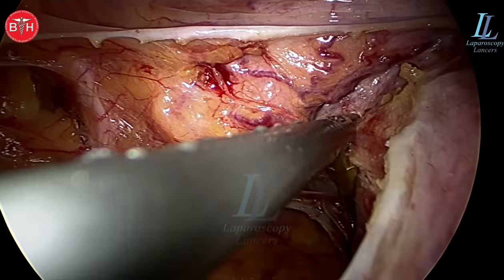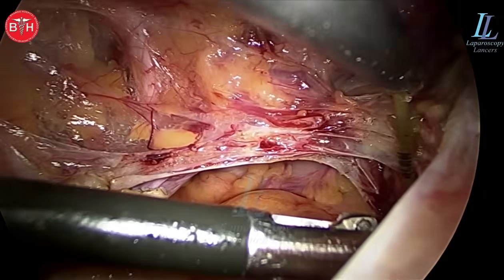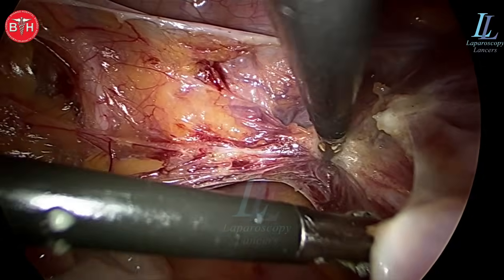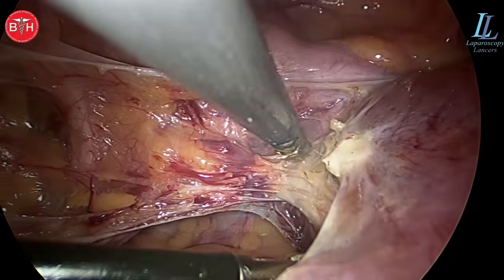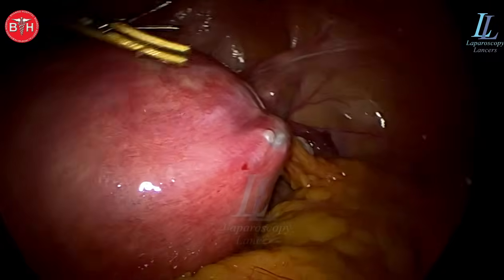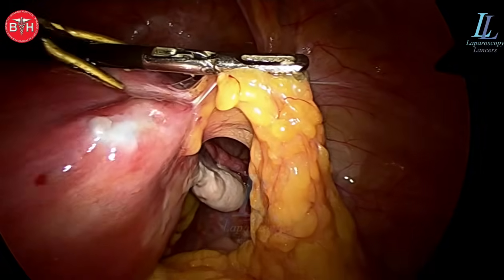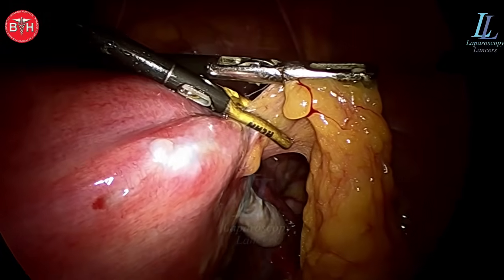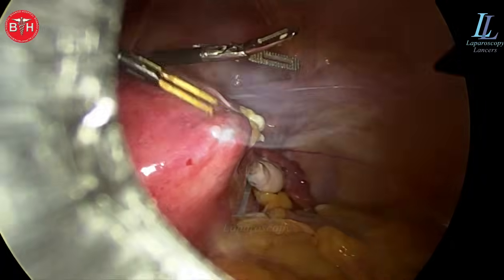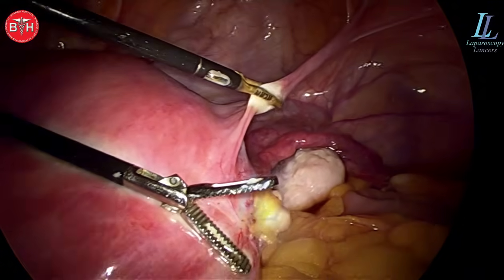Use the Marwa's manipulator as it pushes the cervix so nicely that the fornices are there for the dissection. A bit of coagulation — this two to three centimeter of coagulation towards the uterus avoids back-bleed, which can cause a bit of mess. After coagulating the arteries I have shifted to the other side. I have not yet divided the uterine artery on the left side, and there are a bit of adhesions of the omentum. As you can see, a tubectomy has been done on this patient, so a bit of adhesions really doesn't matter. There you can see the large uterus.